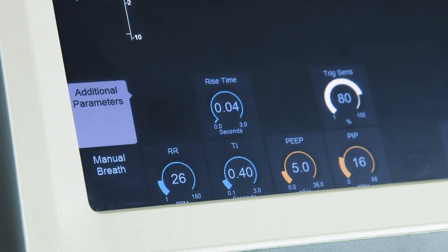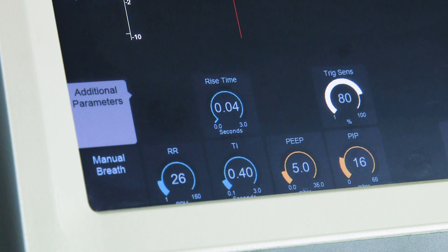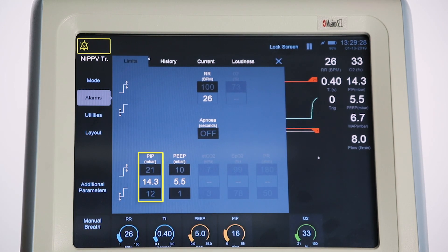The user can also set additional parameters which are displayed when the mode is first selected. Rise time: the time to reach the PIP for manual or backup breaths. Trigger sensitivity, which adjusts the threshold for breath detection — the effort required by the patient for the ventilator to recognize the breaths. The higher the number, the greater the sensitivity to detect small breaths. The ventilator automatically sets alarm limits around the set values which the operator can amend in the alarm panel. Alarms include high and low PIP, high and low PEEP, high respiration rate, and apnea alarm — default is off but requires setting.